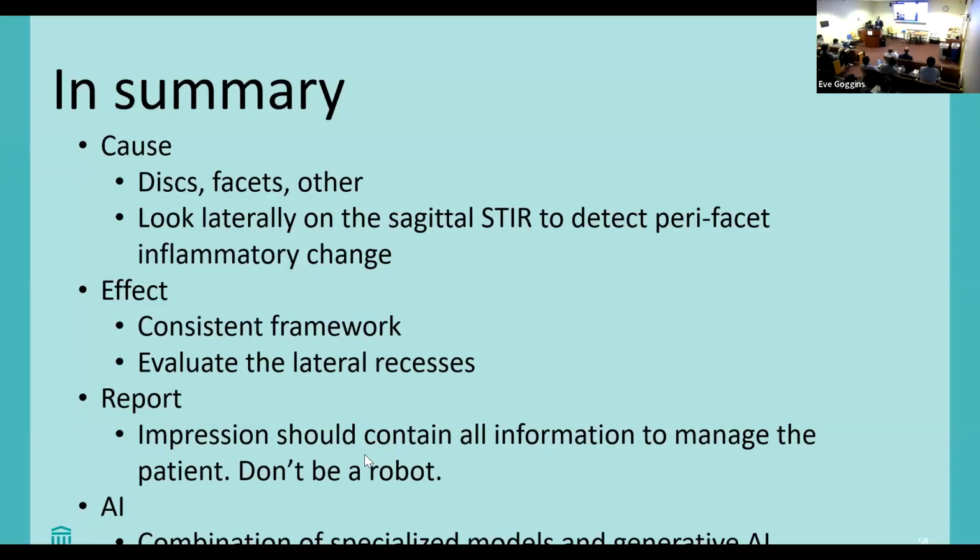That's a good question. And does this framework apply to CT and MR? It's really just on MR, because the way it was defined, how the nerve roots and the CSF and the epidural fat and the nerve are interacting can really best be seen on MR. If you really window things and it's a high quality CT, you can probably read a CT the same way you read an MR.